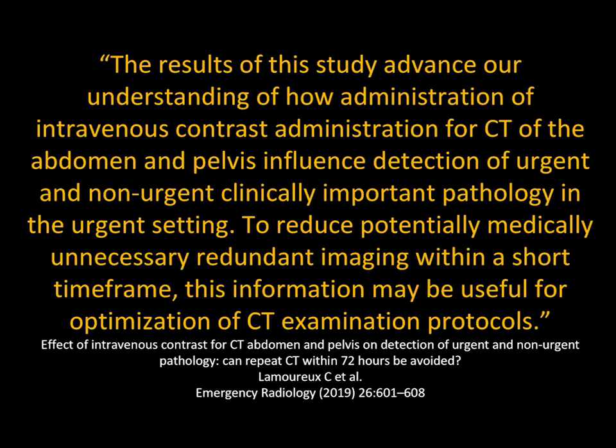And the conclusion was, the results of this study advance our understanding of how administration of IV contrast for CT of the abdomen and pelvis influenced the detection of urgent and non-urgent clinically important pathology in the acute setting. To reduce potentially medically unnecessary redundant imaging within a short period of time, this information may be useful for optimization of CT protocols. The bottom line is use IV contrast. Why do the study twice?